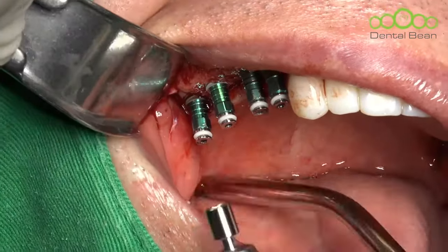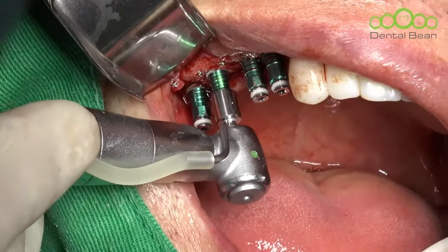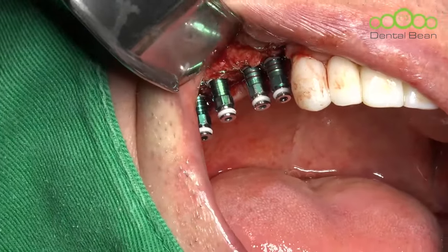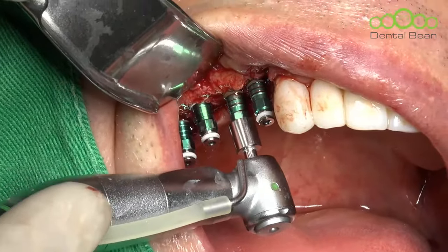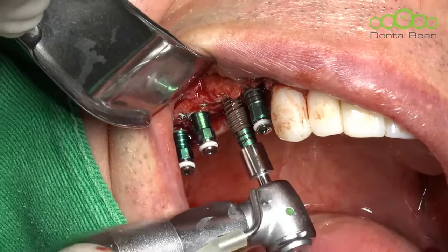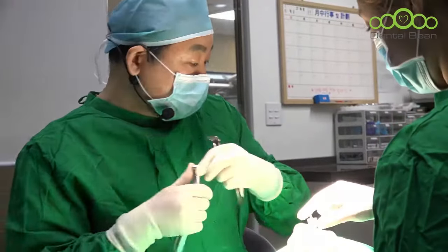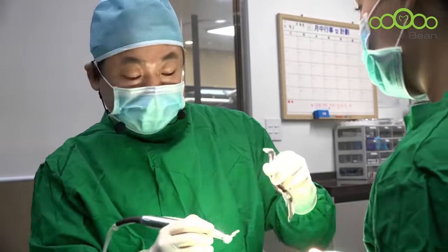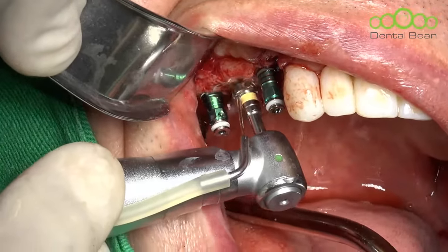Well, I think the position of the second premolar looks not ideal. Slightly too near, very slightly. I'll change it. Even though I use the surgical guide, during the preparation there is some migration of the hole, so it happened. So I will change position slightly distally with a burr. It's very simple. So simply prep the hole again, then let's place again.